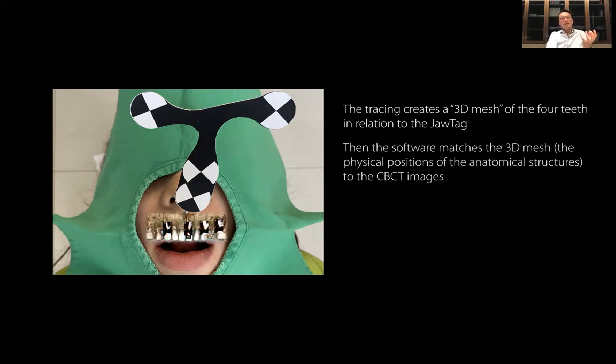And then the system, once it gets the information of the 3D mesh of the teeth, it would match it with the CBCT scan image data inside the software. So now the computer is matching the position of the teeth to the CBCT.